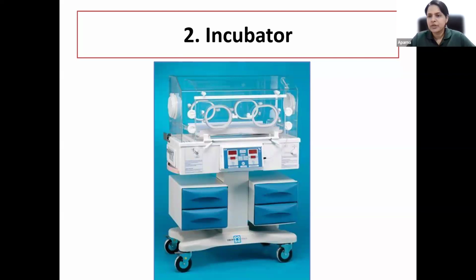It may cost up to 15 to 16 lakhs based on the configuration, whereas a radiant warmer may be available to you at almost 1/10 of this cost. The incubator also is more cumbersome to clean and sterilize because one has to take care that all the corners of the incubator are to be thoroughly cleaned with a swab. But there are some important advantages.